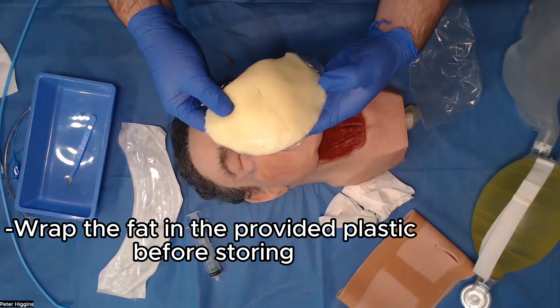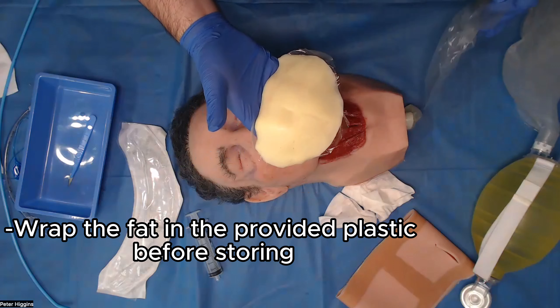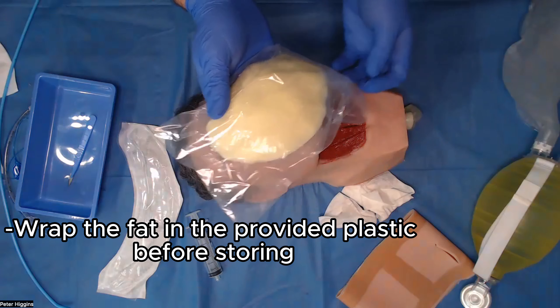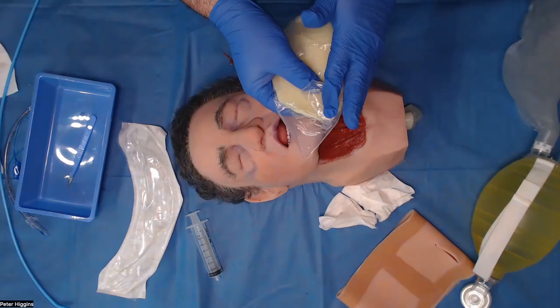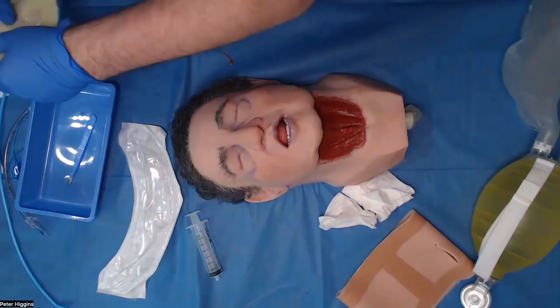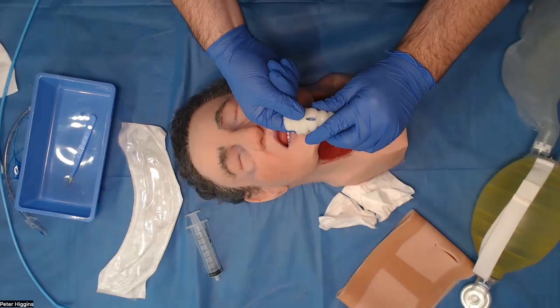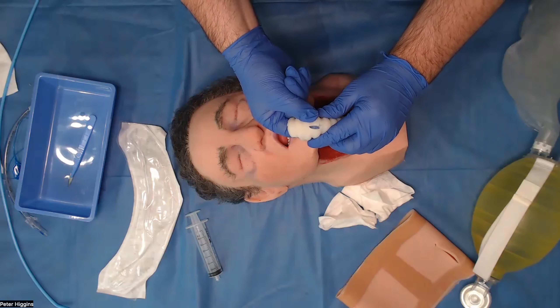Make sure that before you put this away, the fatty tissue, due to its sticky nature, is very well wrapped so you don't get any extra fluff, dust, or any other detritus attached to your fatty layer. Removing the trachea, you can just pull it straight out from the bottom here. Here's my incision right here, just at the top.